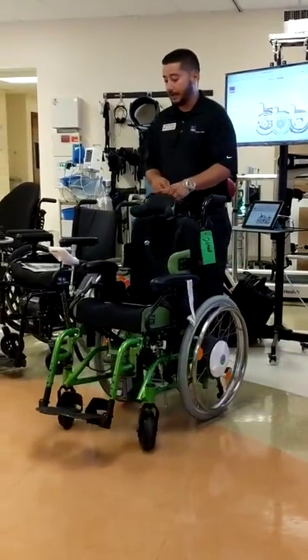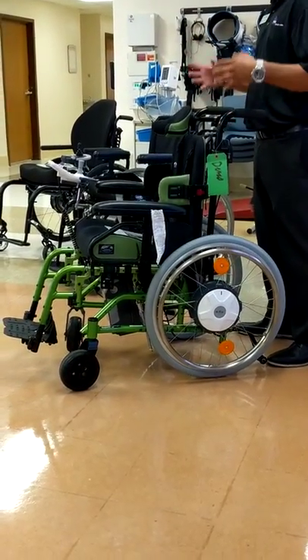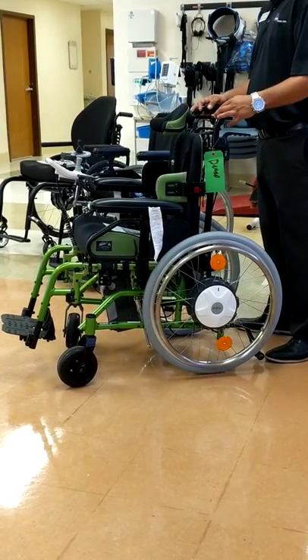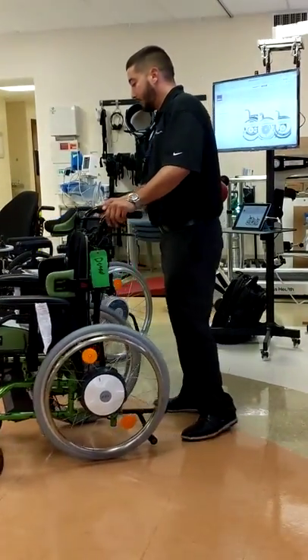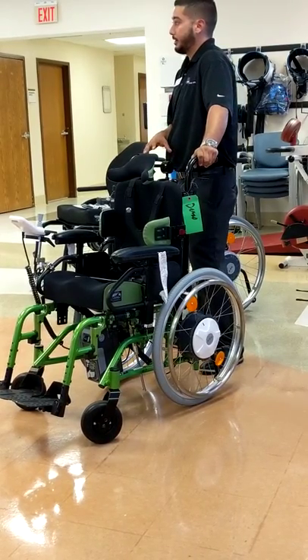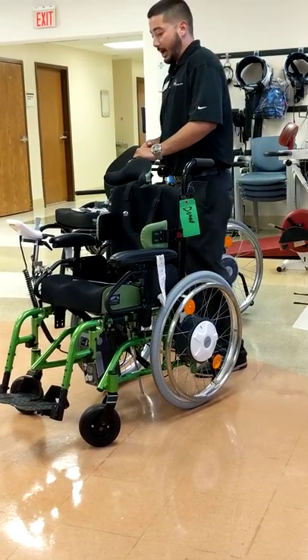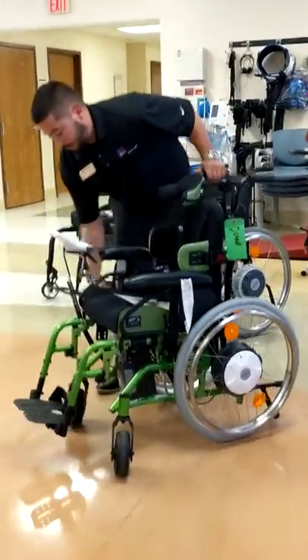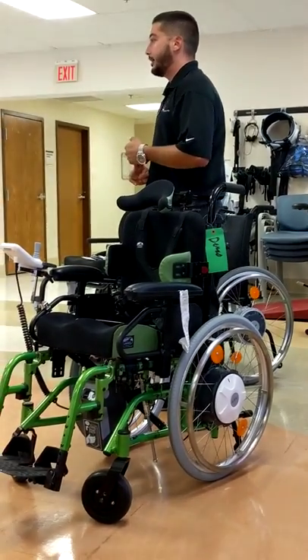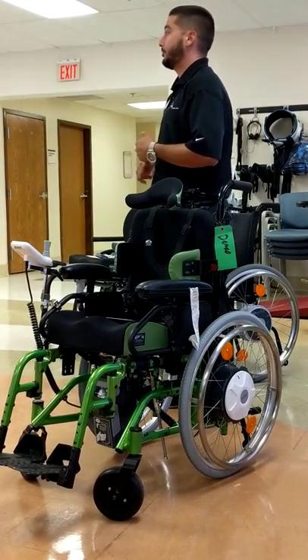With the E35, we have it set up on an NXT, which is a Freedom Designs chair — one of the other seven companies that works in hand with InvoCare. This specific chair is just your standard tilt-and-space chair, and we've added the power add-on feature to it. We put brackets onto the chair, so you're capable of putting your manual wheels back on or putting the power on. We add the wheels, the battery pack underneath, and then we mount the joystick.